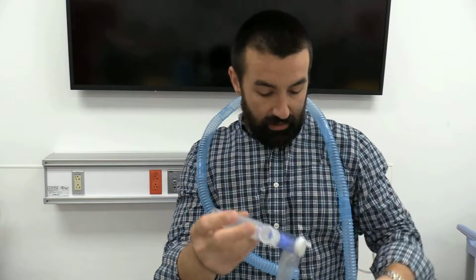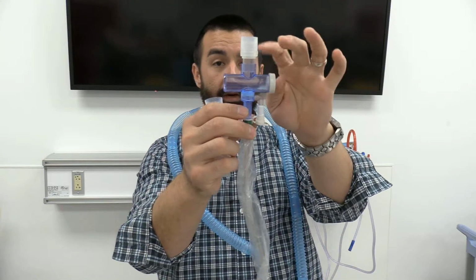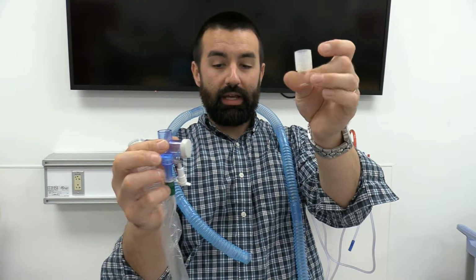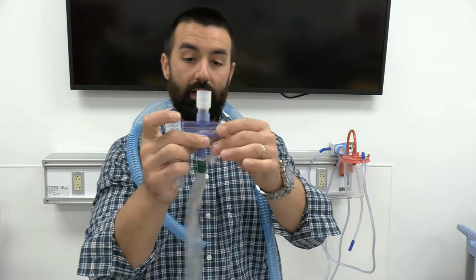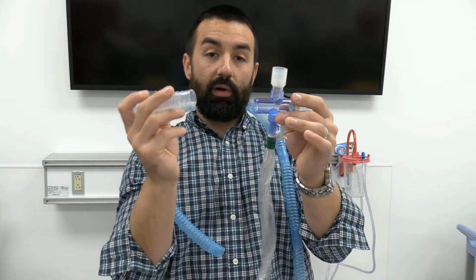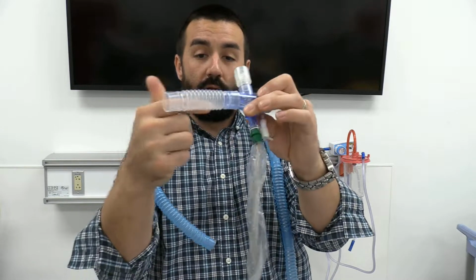So you can see we have a similar design. It's a T. We have another little swivel adapter to take some of that airway torque off. It's just 15 millimeters, so it goes in right like this. This will hook onto a patient's trach right here. We use these a lot for inline mechanical ventilation. In mechanical ventilation, we have to maintain a closed system, and inspiration and exhalation is all happening through the machine. I have a cap on one end, so this would hook up to a ventilator circuit.